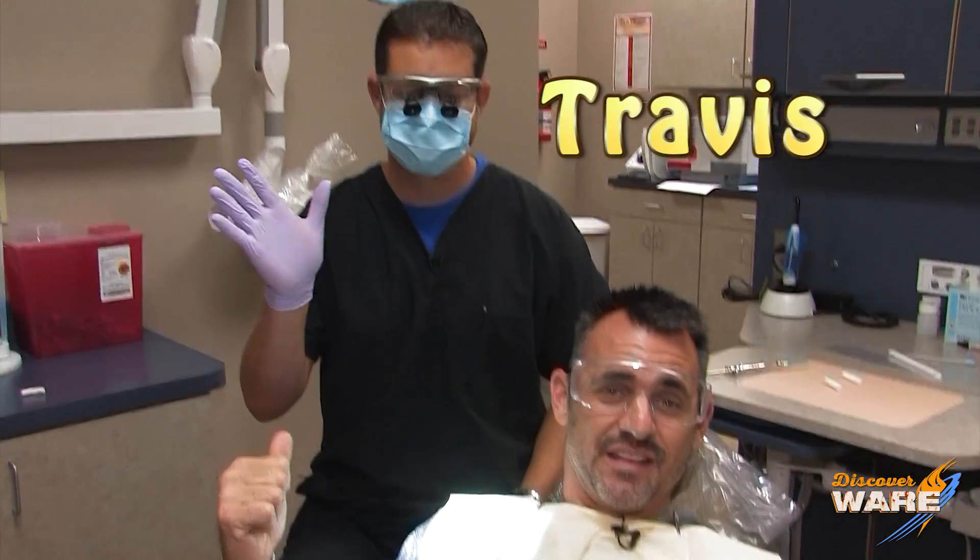Just kidding, I'm not in pain — we're having some fun here. We're continuing our series with my friend Travis, my dentist, talking about things that we use every day that require steam. We're going to be talking about sterilizing instruments in the dentist office on Steam Culture.